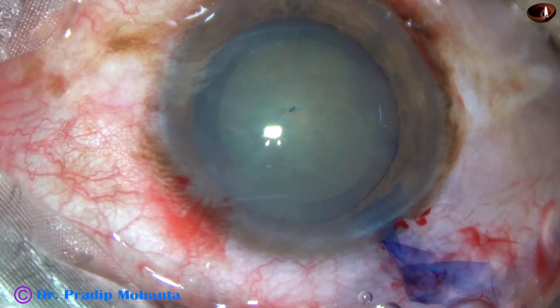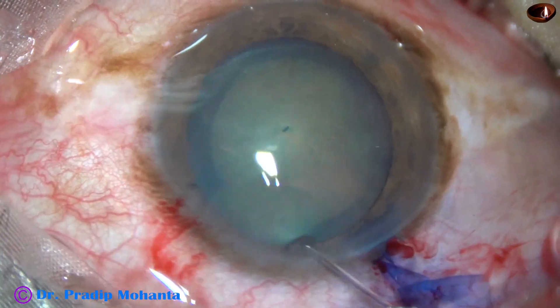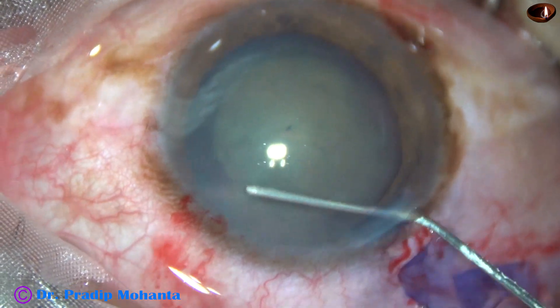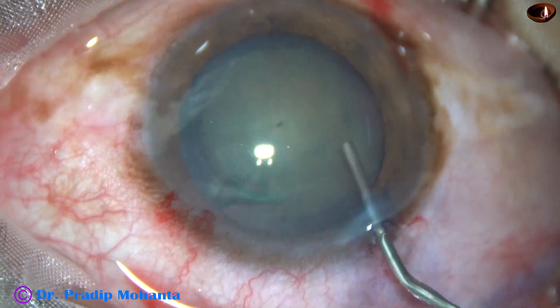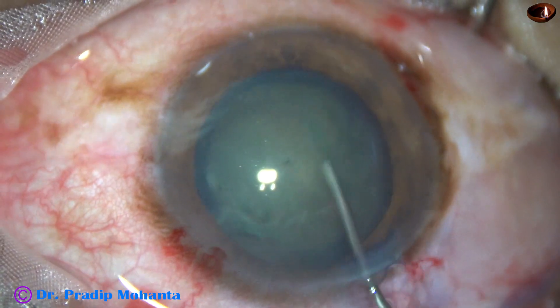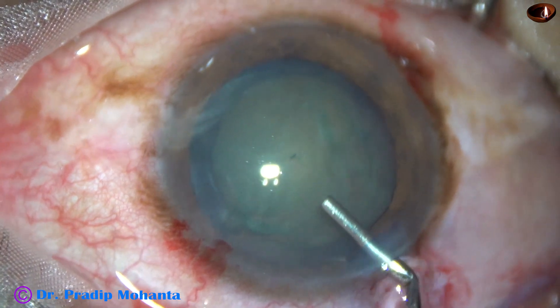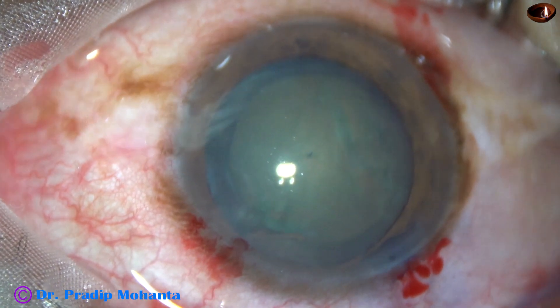Hydrodissection is done with the help of a 27-gauge cannula and BSS. Some amount of viscoelastic is expressed out and BSS is injected at the equatorial part of the capsular bag. The nucleus is depressed and some more viscoelastic is injected.